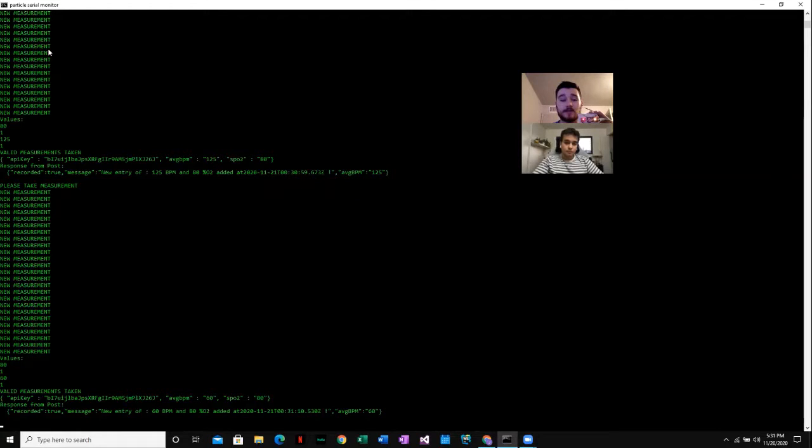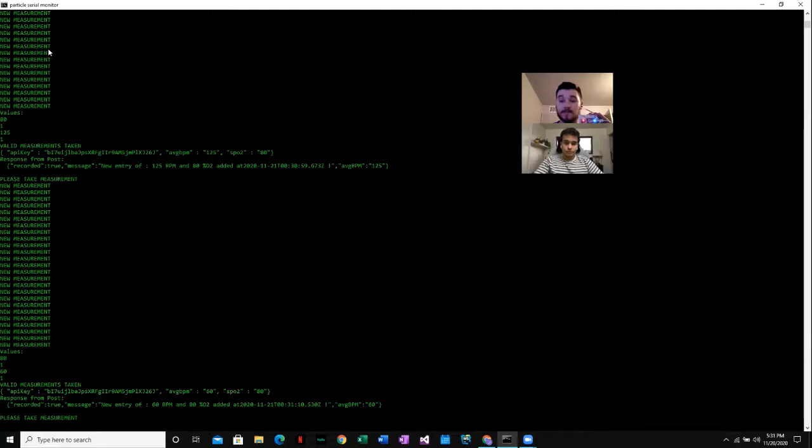And it's back to yellow. The post gets recorded on the server, and then it's back to blue and blinking. So that's the full state machine representation of our particle code.